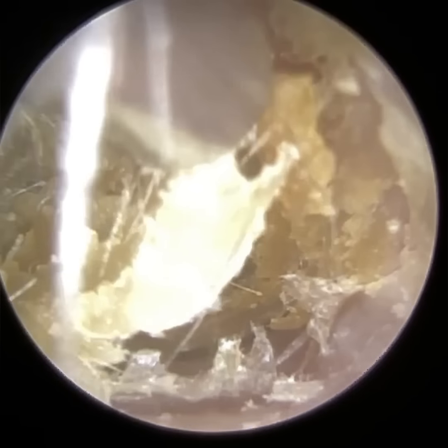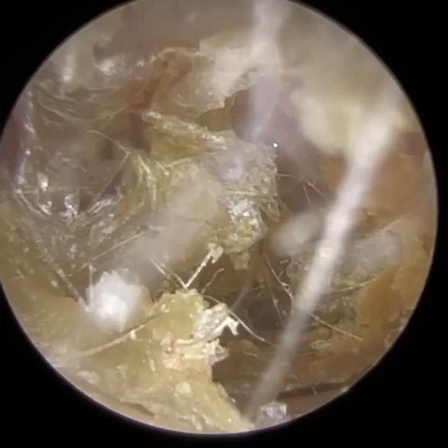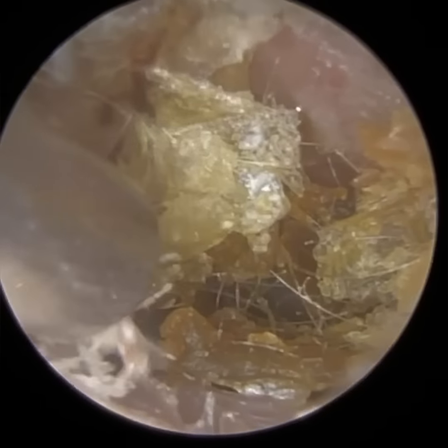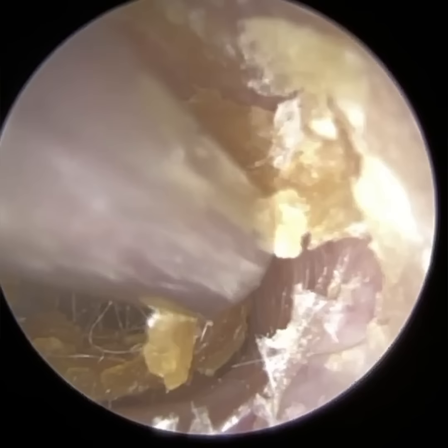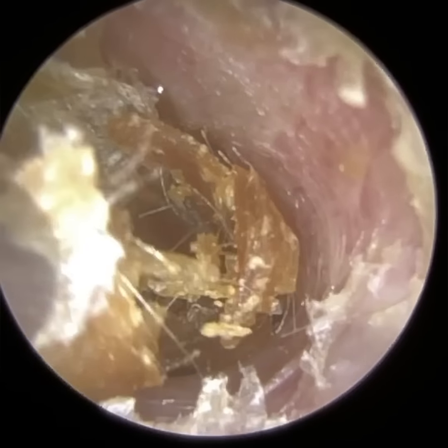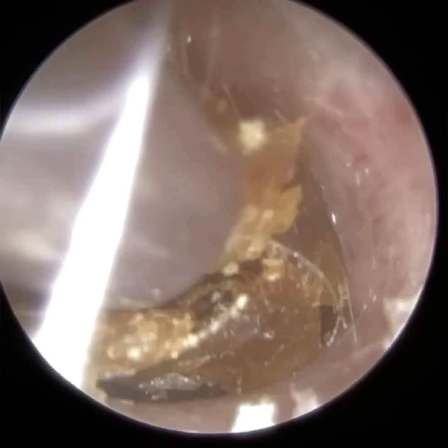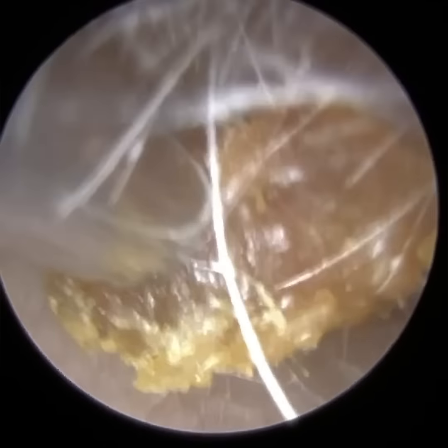Now, it's not visible at the moment, but this patient has quite a large posterior tympanic perforation, so a hole in the eardrum. And it's really interesting because once I remove this occlusion, we can actually visualize their middle ear. There's one structure called the round window, which I'll describe in more detail in a moment, that you can clearly visualize, and I've freezed that moment and annotated it for you guys. Now, it's probably the most crusted dead skin that I removed. You'll see why in a moment.